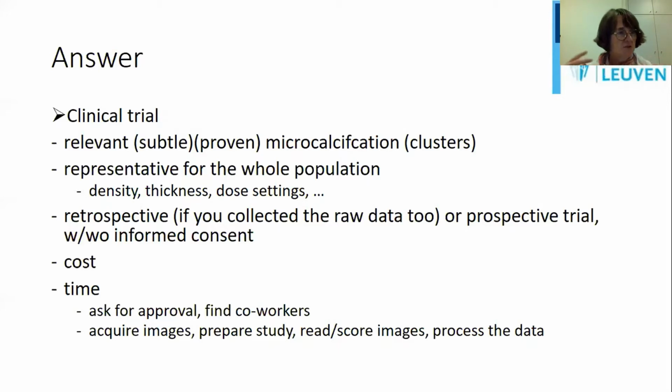The whole ethical committee approval would be more difficult and so on. And the costs start to increase. It would also cost you time. You would need the approval. You would have to find co-workers who would want to help you. You have to acquire the images, to prepare the study, to read, to score the images, process the data, and then probably make the reports and a paper. This is very time consuming.